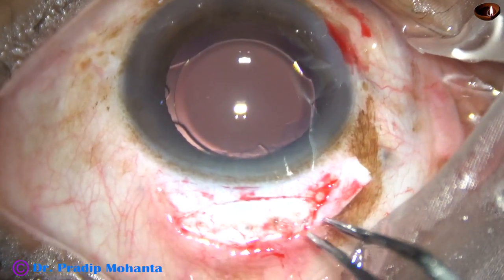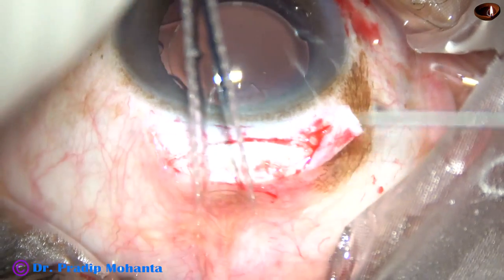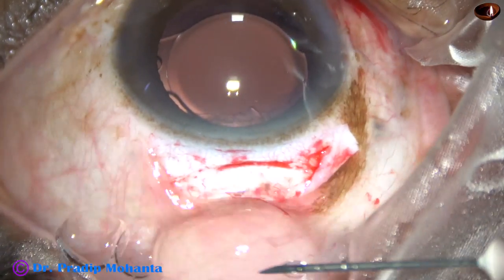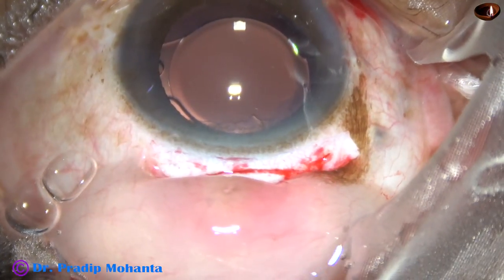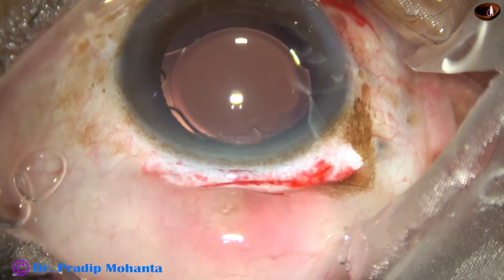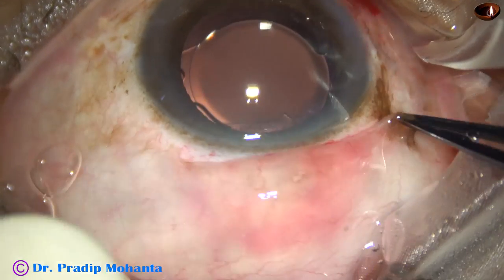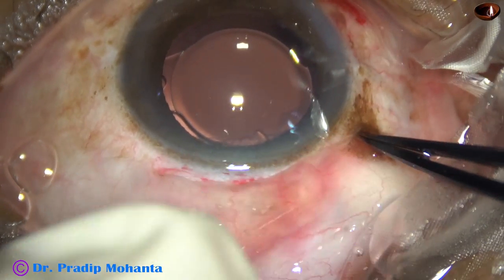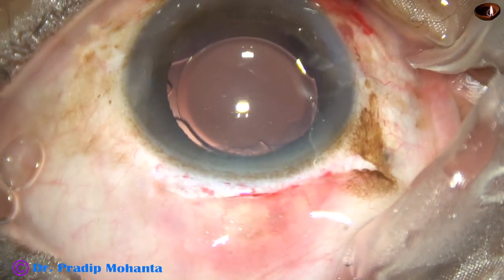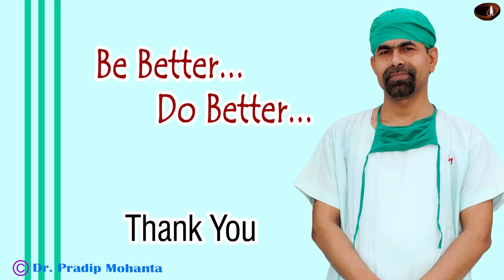Now the conjunctiva has to be opposed to the limbus. In this case I am going to use subconjunctival injection of gentamicin and dexamethasone for apposition of the conjunctiva to the limbus. As we remove the speculum, the conjunctiva will remain there. See — as I remove the speculum, the conjunctiva gets opposed to the limbus.